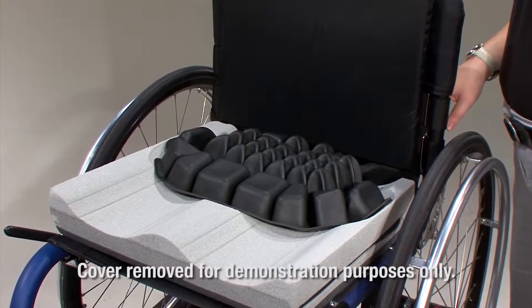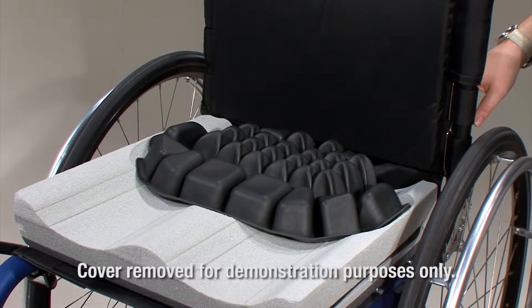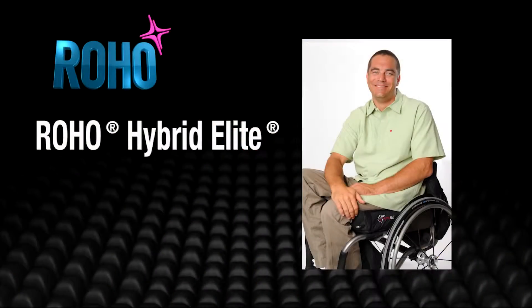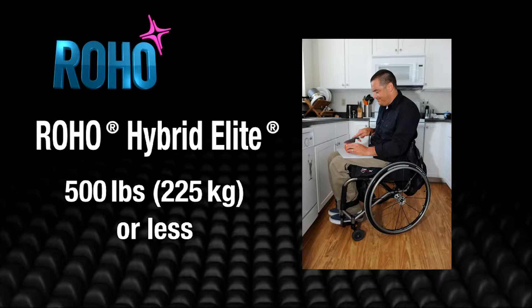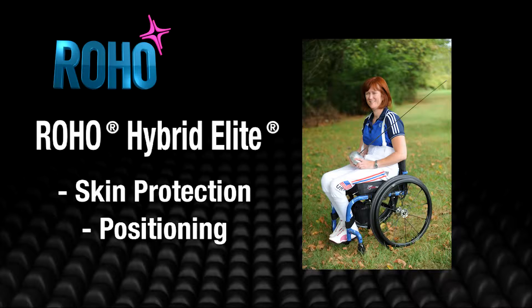The Hybrid Elite is a wheelchair support surface with a Roho dry flotation, air-filled, adjustable, cellular design insert combined with a contoured foam base designed to conform to a user's seated shape in the pelvic loading area. The Hybrid Elite is recommended for individuals who weigh 500 pounds, 225 kilograms, or less, and who may require skin protection, positioning, or both while seated. Roho Incorporated recommends that a clinician, such as a doctor or therapist experienced in seating and positioning, be consulted to determine if the Hybrid Elite Wheelchair Cushion is appropriate for the individual's particular seating needs.